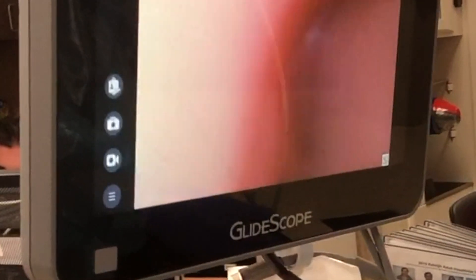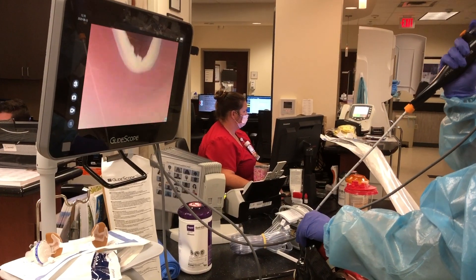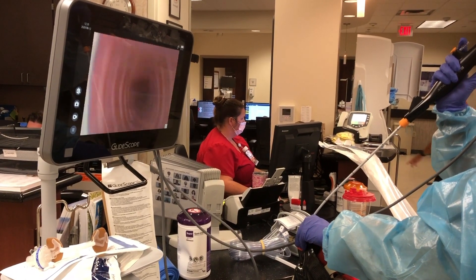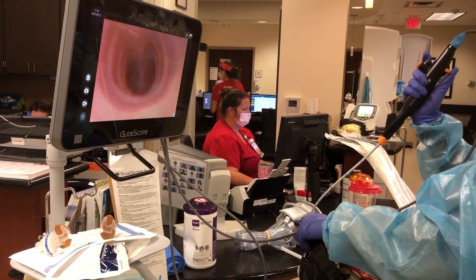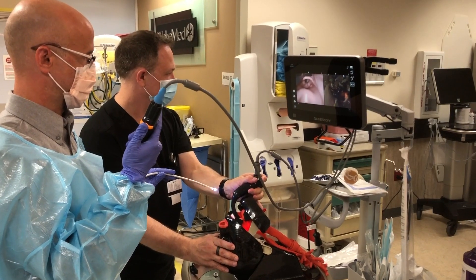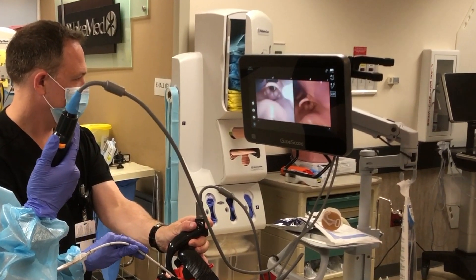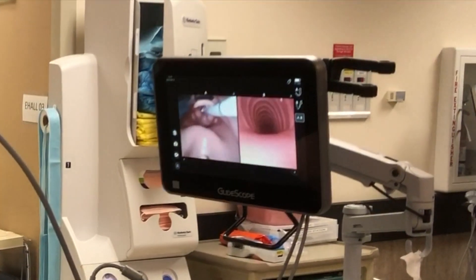Our new GlideScope can fiberoptically intubate through the nose. With decongestants, anesthetics, and a cooperative patient, you can negotiate through the nares and find the trachea. But going through the mouth is even easier. If you have an assistant, use the traditional GlideScope blade, and then you go through the mouth with the fiber optic.